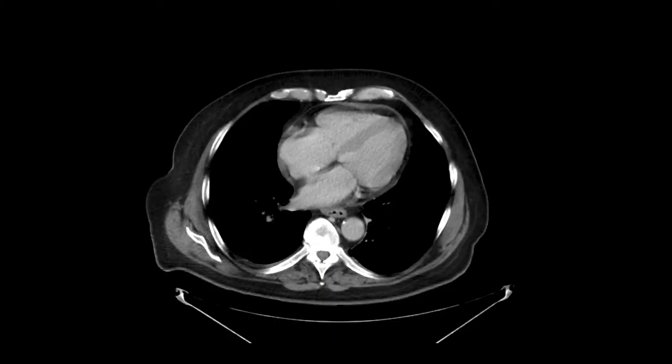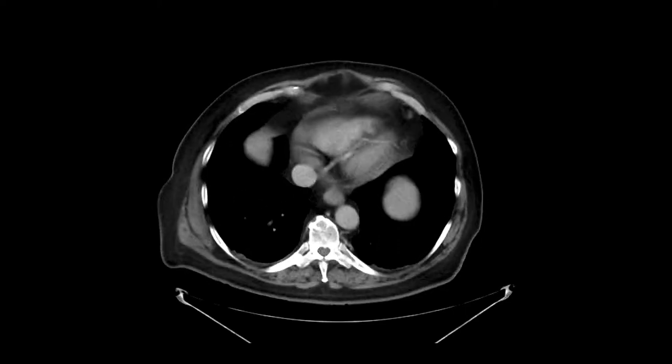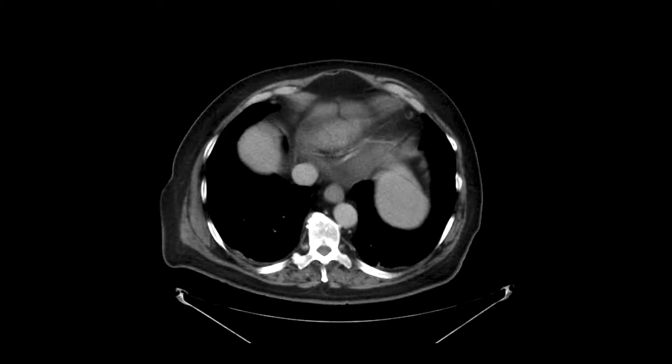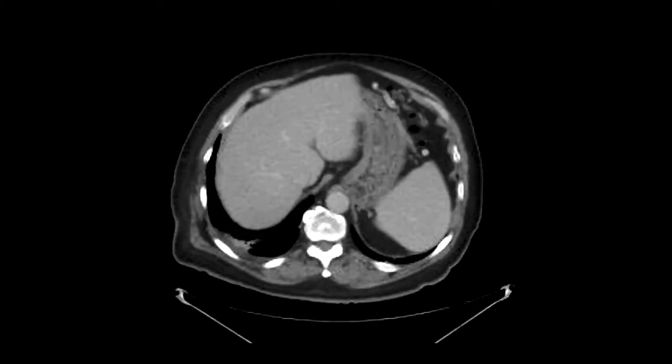This is a patient, 80 years old, gentleman with abdominal pain, jaundice, and anemia, and they're looking for a cause of all this. So we've got a CAT scan with intravenous contrast.